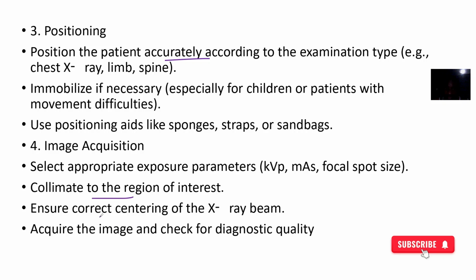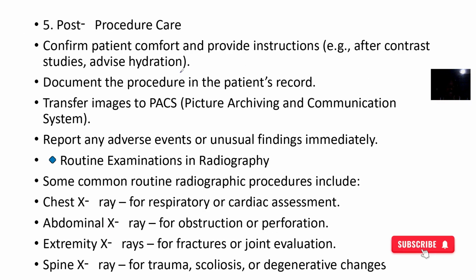Also ensure correct centering of the X-ray beam. Acquire the imaging and check for diagnostic quality. Then after the procedure, you are not just leaving the patient, but you are helping the patient off the radiation bed, and making sure that the patient gets back to where they are being cared for. Then you have to document everything that happened within the procedure.